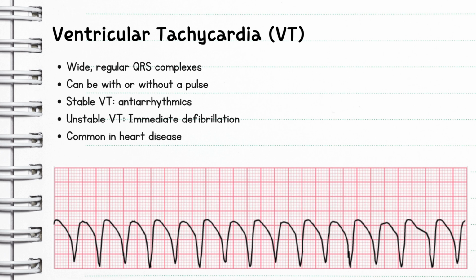Okay. And also remember, the key is to assess the patient first. Don't just rely on the monitor. We treat the patient, not the monitor. If you see this on the monitor, you need to look at the patient. Okay. Obviously, hopefully the patient's awake, but if they're not, obviously follow the steps in ACLS.